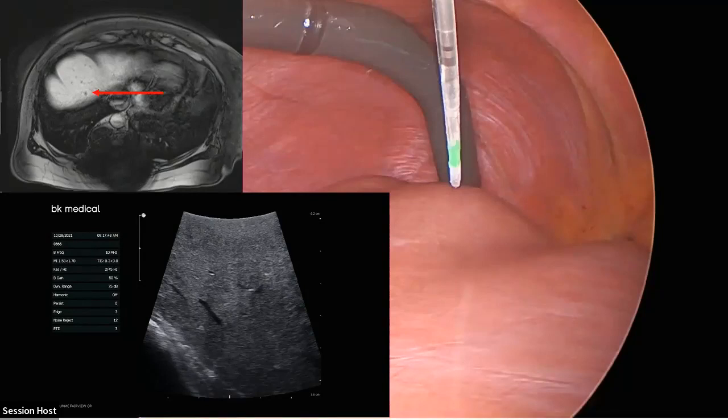And actually, this was just mentioned as well. I have the ultrasound coming from the right flank. And I do that because of what this picture shows, which is I'm going to show a series of images. These are movies too, but I can't control them with a keyboard here, so it's going to be a little bit screwed up. But with this setup, you can basically hit any segment of the liver, any part of the liver. This setup will allow you to treat it. I always have the ultrasound coming from the right. It's angled so I can get the needle under it if I'm targeting something.